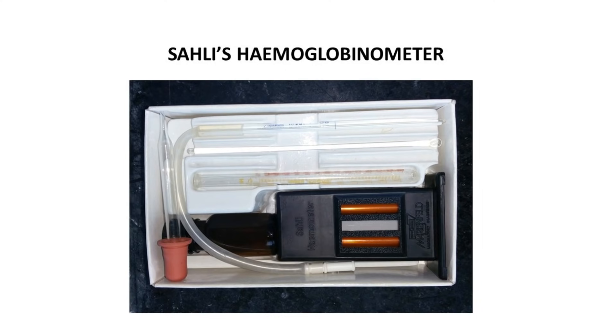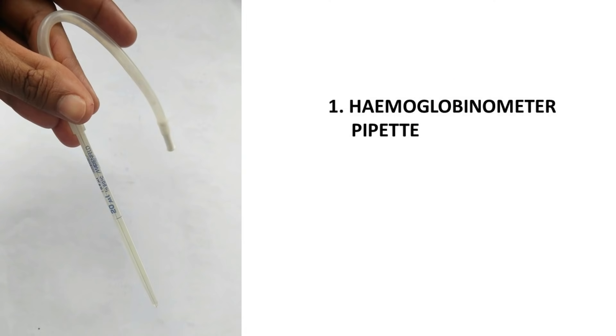This is the Sahali's Hemoglobinometer pipette. There is a 20 microlitre mark on the hemoglobinometer pipette, up to which we have to fill the blood.